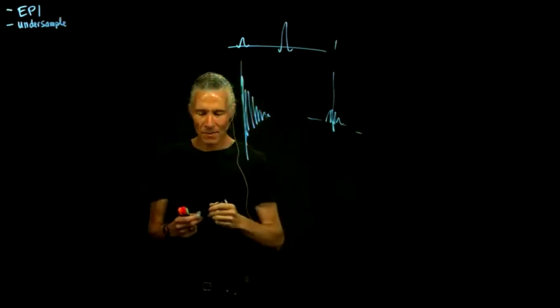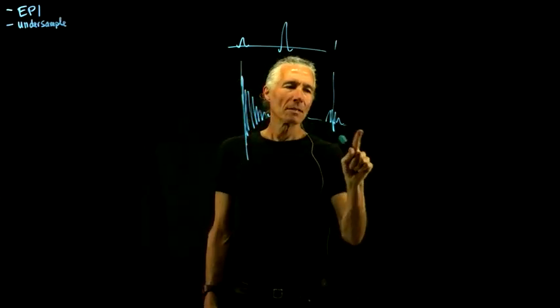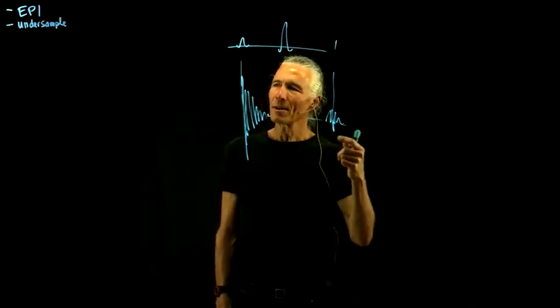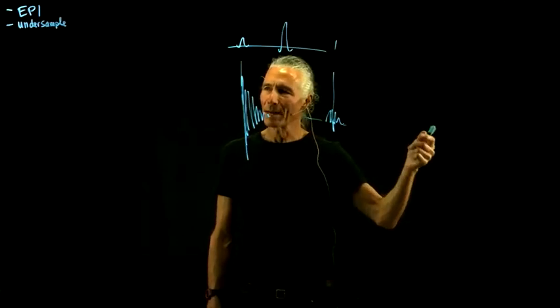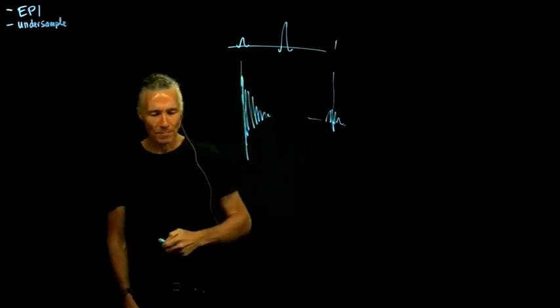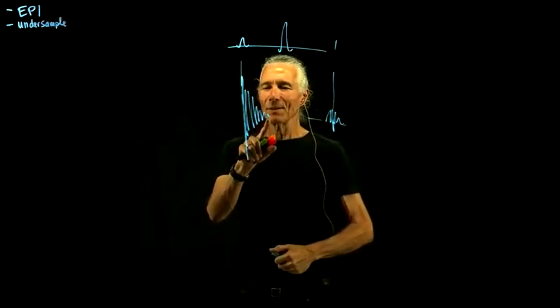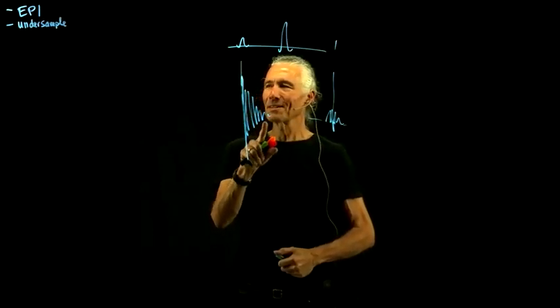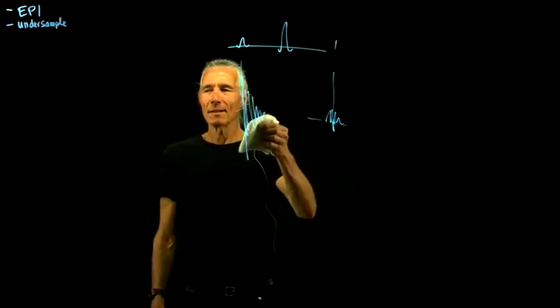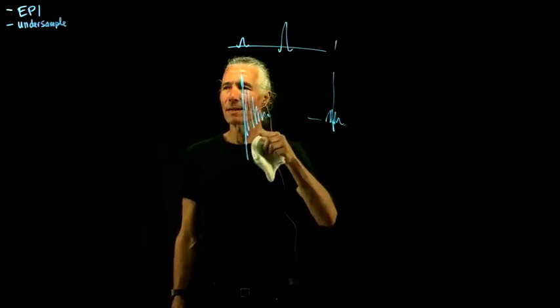And so in slow spin echo or slow gradient echo, you just record one echo. Then you have this idea of echo trains. You could do multiple 180s or multiple gradient echoes. But it's still not fully taking advantage of all this good signal here. What Echo-Planar Imaging is, is very simple. Let's just record all of the echoes that we need for a whole slice from one FID.